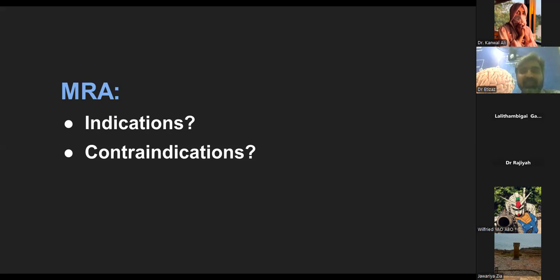MRA, to some extent, has the same indication as the CTA, but it has some superiority over CTA in different aspects.